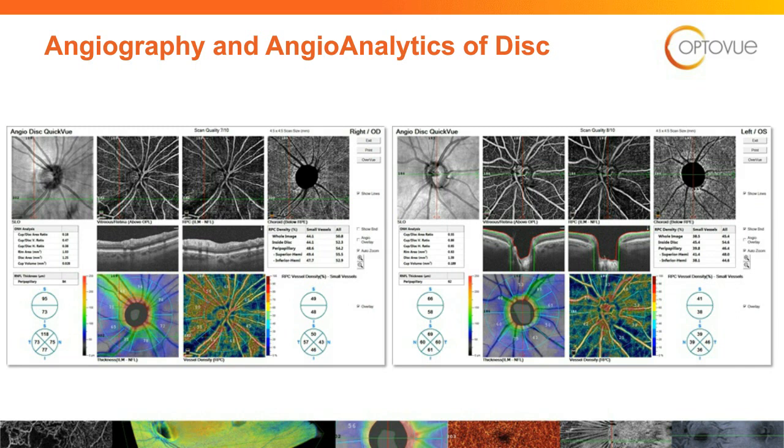Let's go over and take a look at the left eye. The nerve fiber layer is more compromised here. Superior and inferior, you can see that there's less tie-dye. You can see the numbers over here, how that's helping us out. But let's go over to the radial peripapillary vessel density, and we can see 41 and 36.